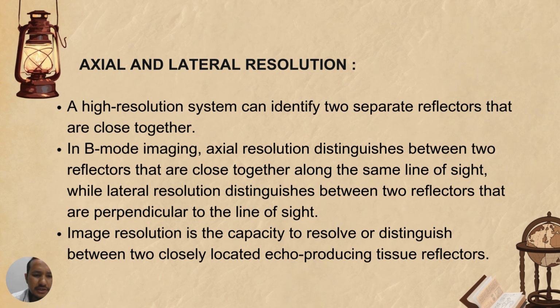So for the conclusions, for the axial and lateral resolution, they have four factors. Firstly, frequency.